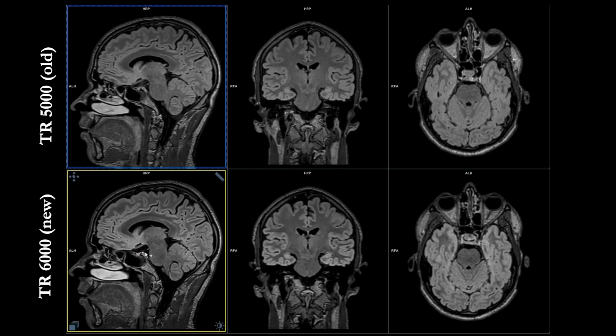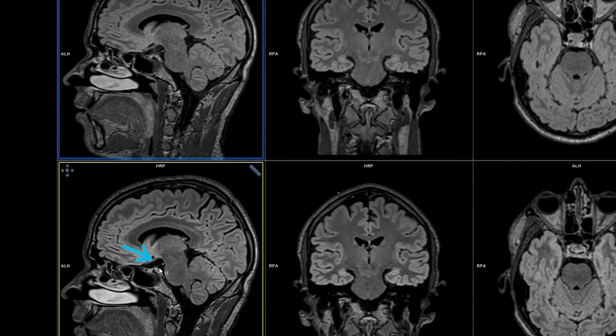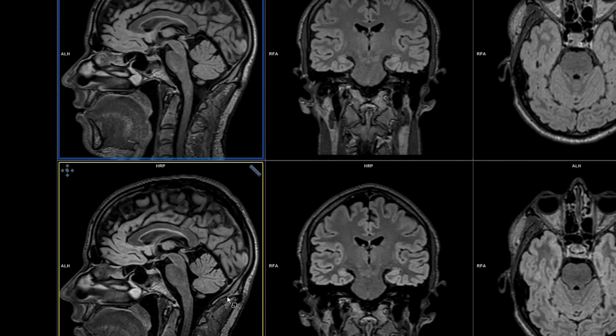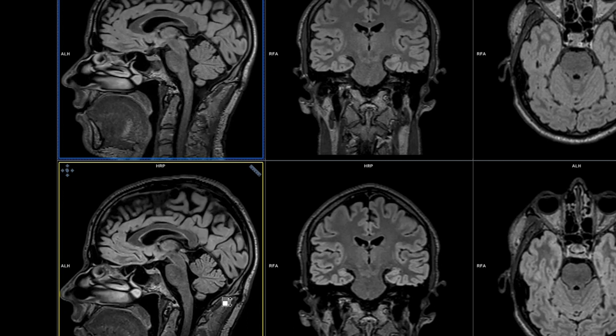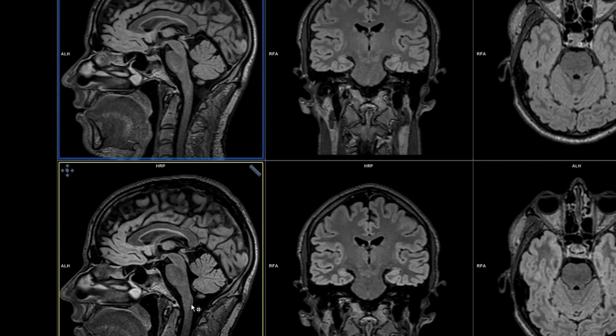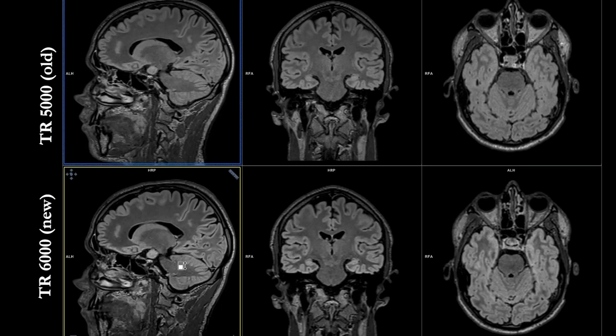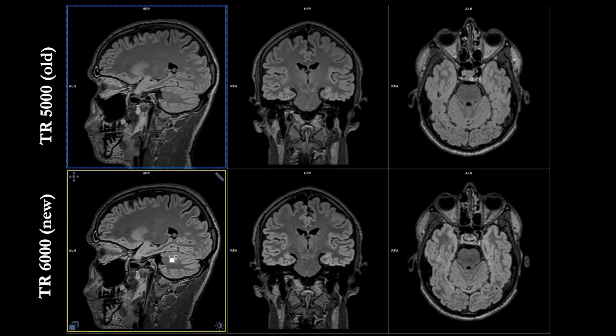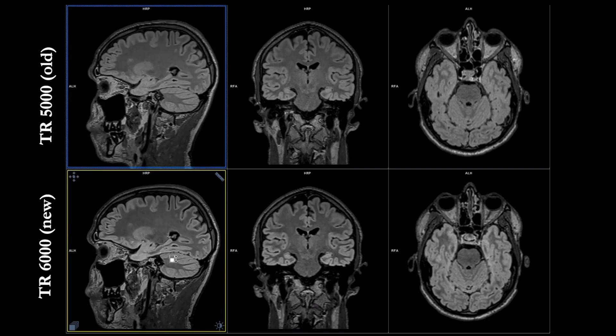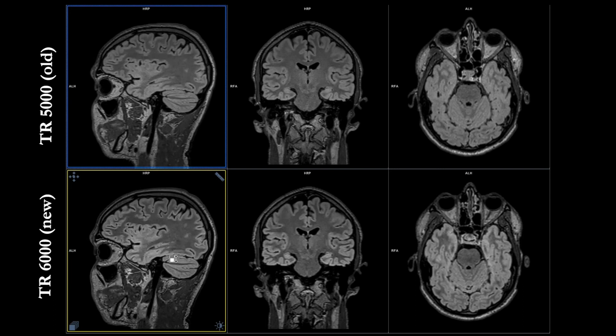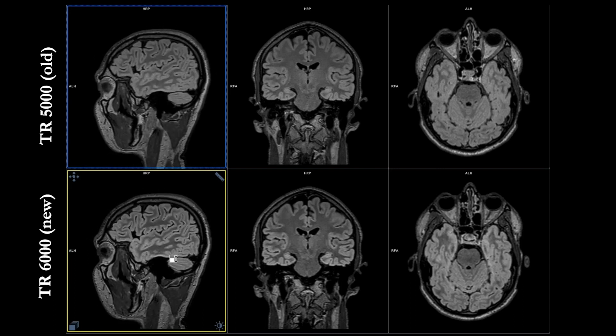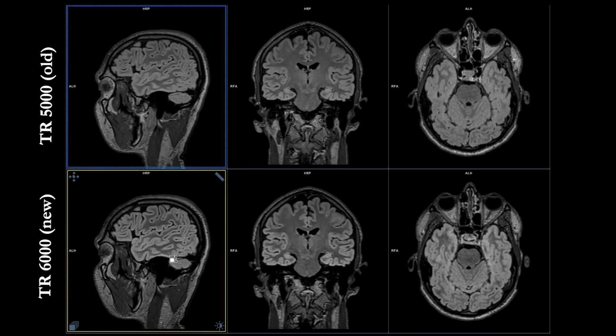I stopped right there. Look at this area right there, the flow artifact is less than the lower row right there. And back here you can see there's also less flow artifact. I also guess there will be more visible when it comes to the pons artifact on the 3T. This is 1.5. The area right there is more suppressed. Overall, the image quality on the lower, I find it much better.